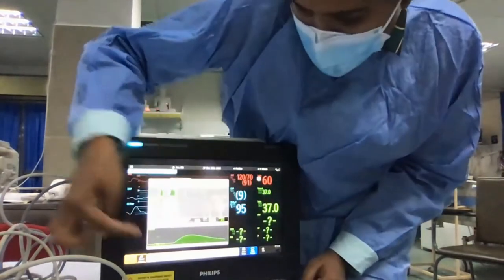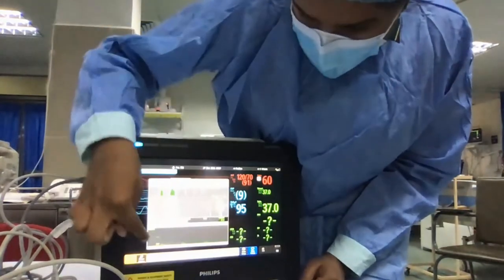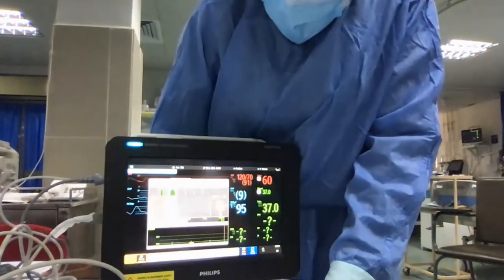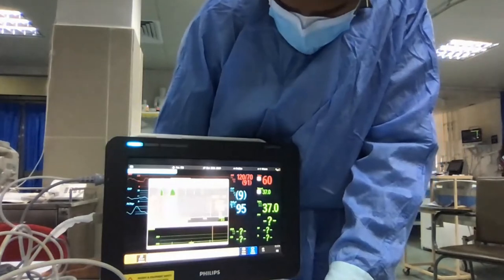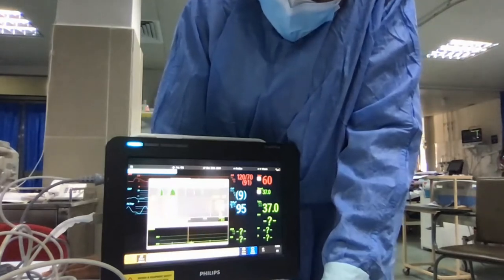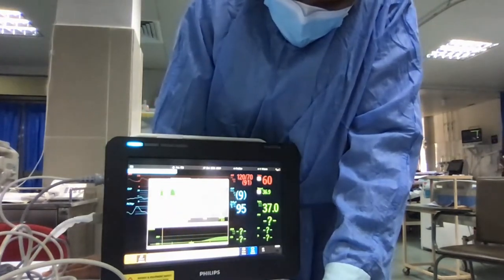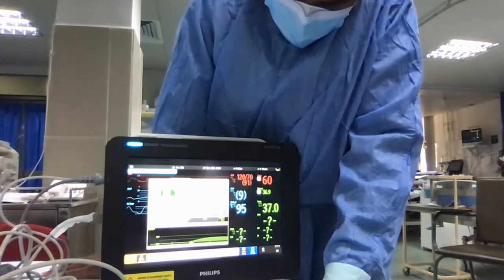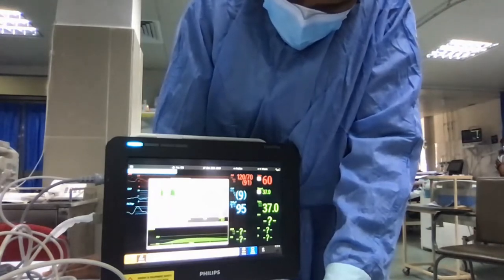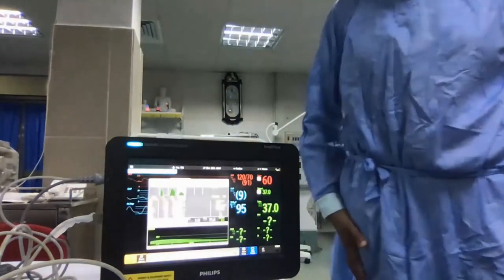I will show you, I'll do another one. Ready for a new measurement. Wait for that message, then start cardiac output. Stable baseline, inject now. Then you can inject. I will do a demo injection. If you were too slow, like if you took more than 5 seconds, the graph will be very flat and sort of elongated.